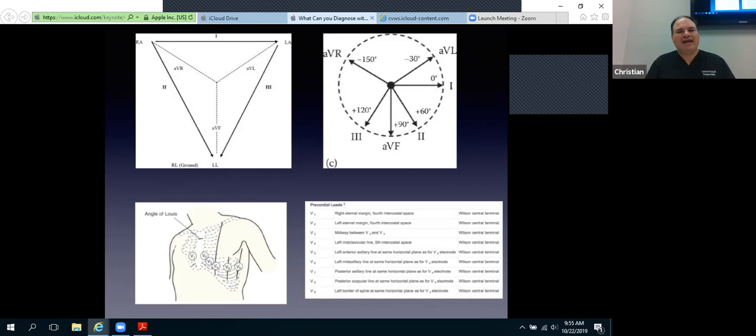And so, what happens when you put the precordial leads up too high? What happens is that you diminish the amplitude of what you're measuring. So you're dampening the amplitude of what's being measured, which means that you're going to underdiagnose ST elevations by doing that. So these are important diagnostic aspects of applying this correctly. Play the instrument well enough for those of us that need to understand what tune is being played to recognize it and act upon it. And if I can't hear what note's being played, I don't know what to do, and it delays care.